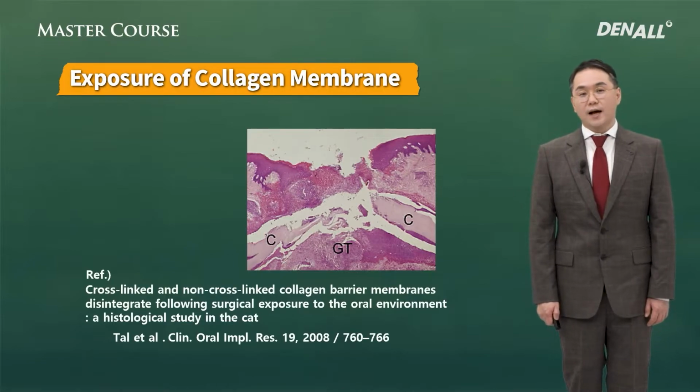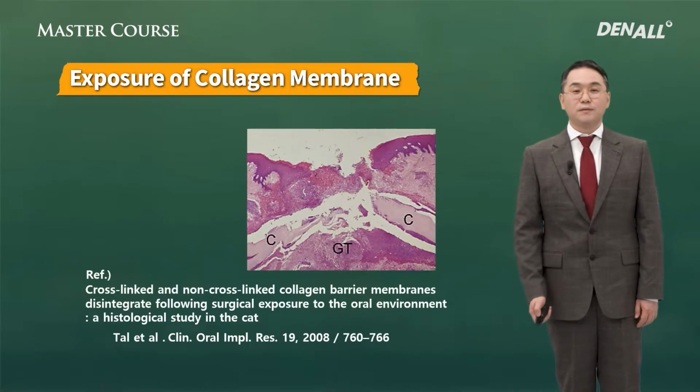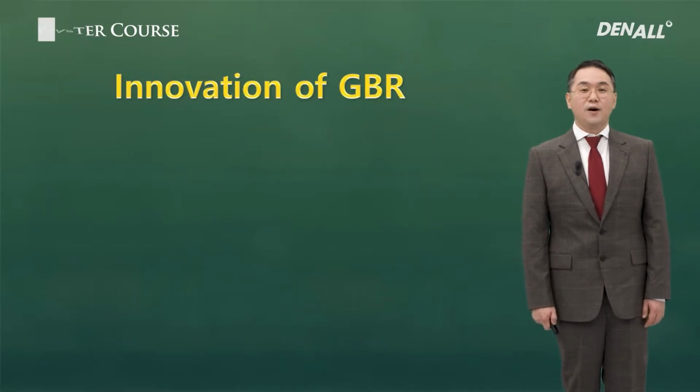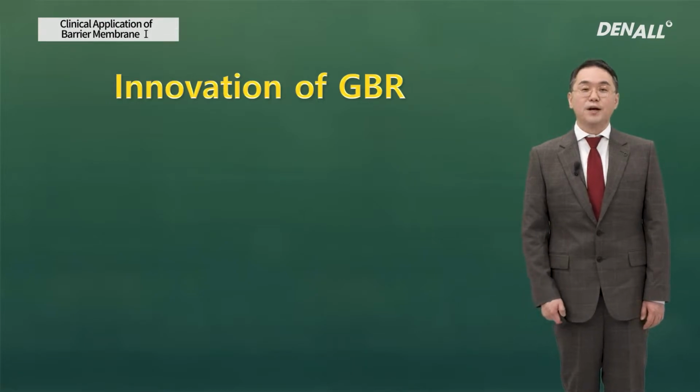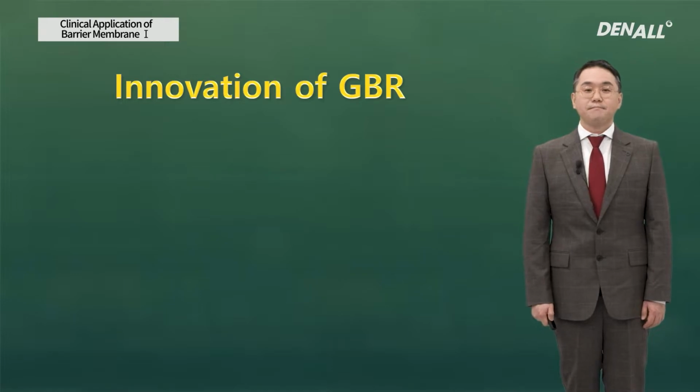Then, how can we use the collagen membrane in a clinical situation where primary closure is hard to achieve? So, today I want to introduce the non-submerged type of GBR.